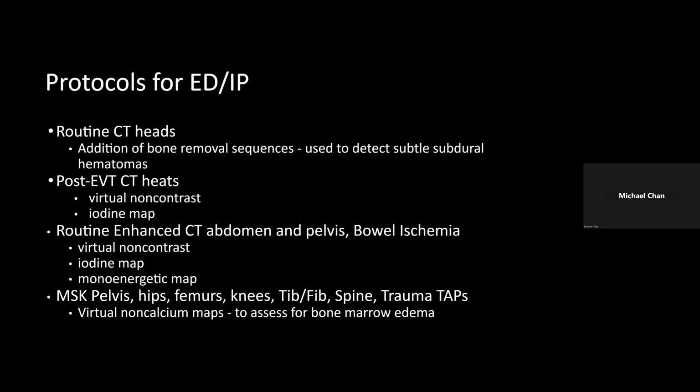Where we'll have virtual non-contrast maps, iodine maps, and monoenergetic maps.